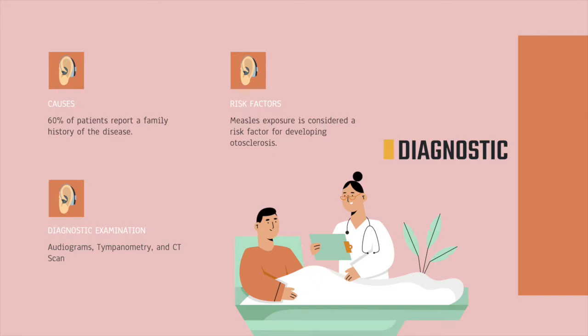Last but not least, the doctor will perform a hearing function examination with an audiogram. These tools, in addition to medical history and physical examination, have traditionally been used for diagnosis of otosclerosis. An audiogram measures air and bone conduction and interactions throughout various frequencies at various loudness levels. After that, we proceed with tympanogram to see the middle ear.